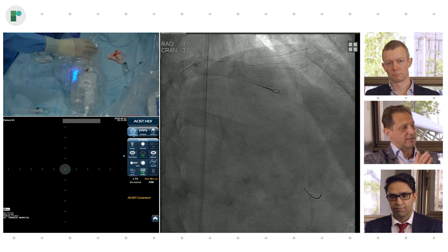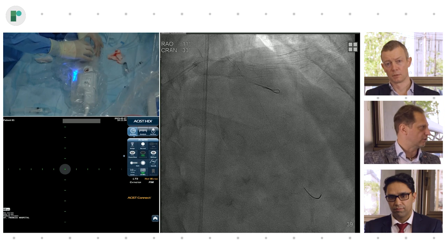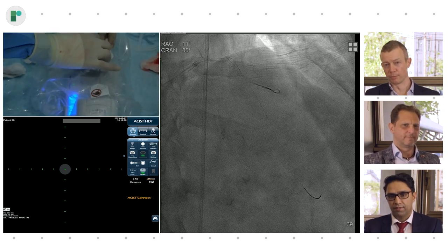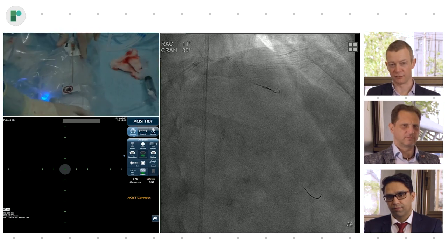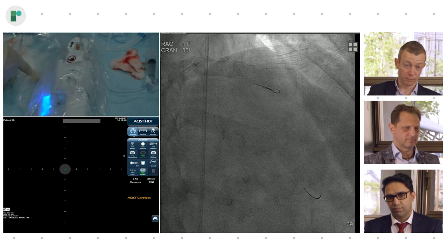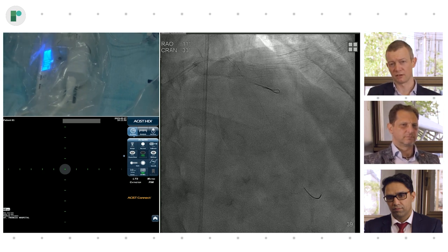And then we know, okay, also when you do your measurements on the device itself, you know exactly how long it is. Critical point. We also do that. So if you go in, start the pullback in a segment that is as healthy as possible. And I think we'll see that in a second. Sometimes it's very easy. You want a segment or a frame in which the plaque burden is close to zero. But in some cases, it's quite difficult. And I think in this case, it's a nice demonstration that it's not always easy.